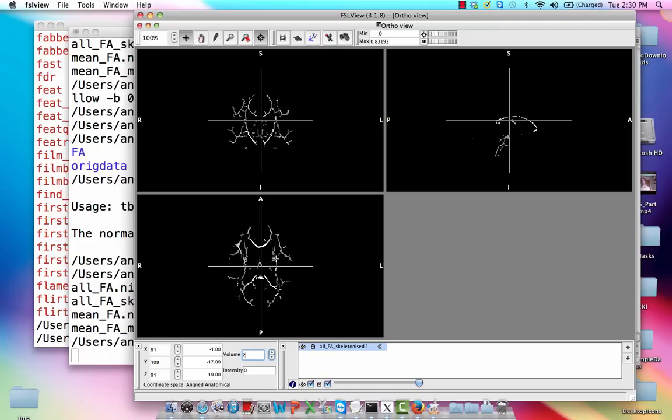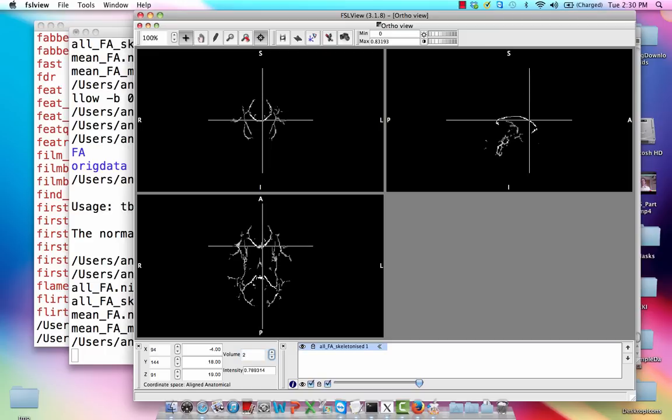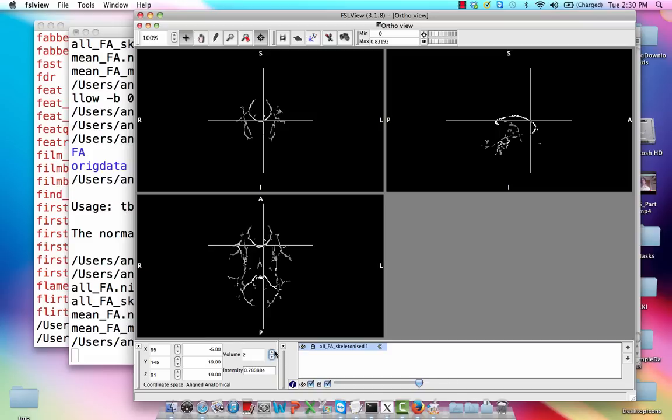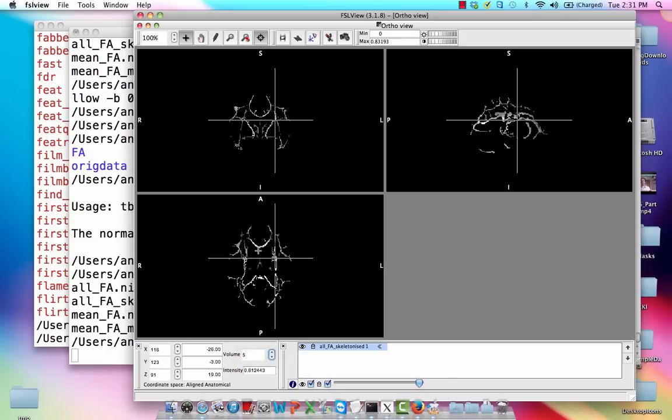You know, we could highlight one voxel within this track right here. It has an intensity of 0.7. And as we go through each of these different subjects, just make sure there's nobody that's a huge outlier. Obviously, there's going to be some variability. But in general, just make sure this looks fine.